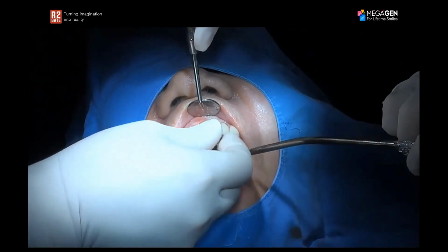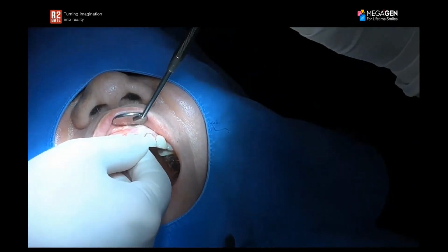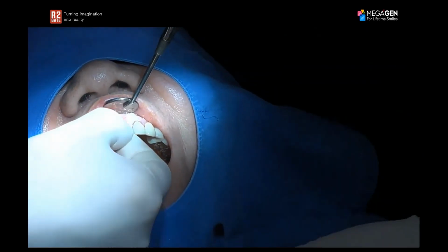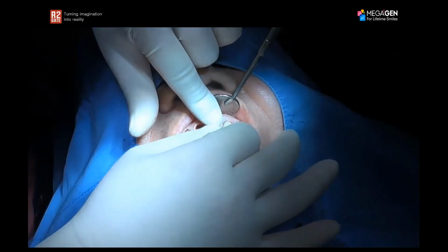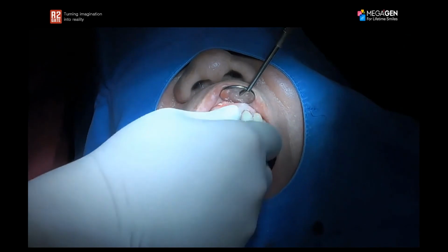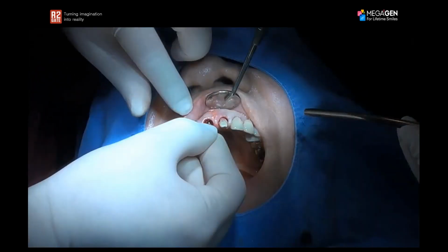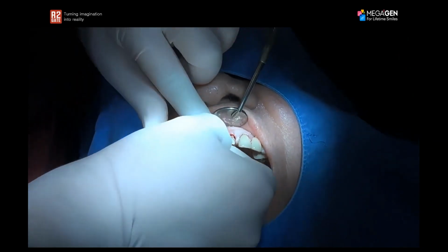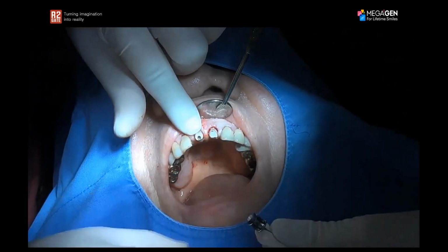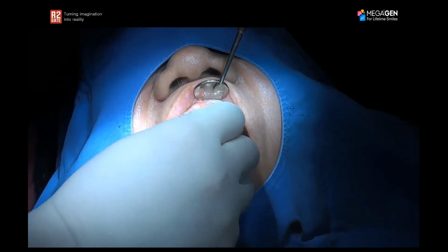After I do that, I can go ahead and remove the cover screw from my implant, and then I'll place the final abutment. In this case, this is a zirconia custom abutment. This is going to be a one abutment, one time type of protocol. And as you can see here, the reason why we did this as cement retained is because the implants obviously are coming out through the incisal edge of the tooth.